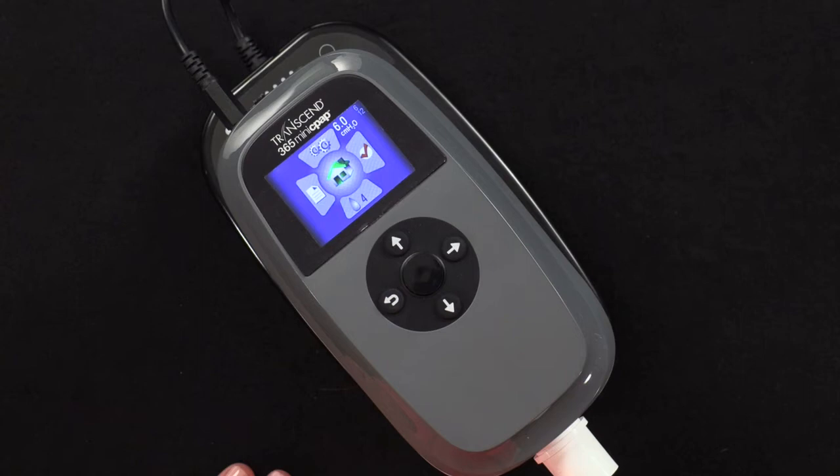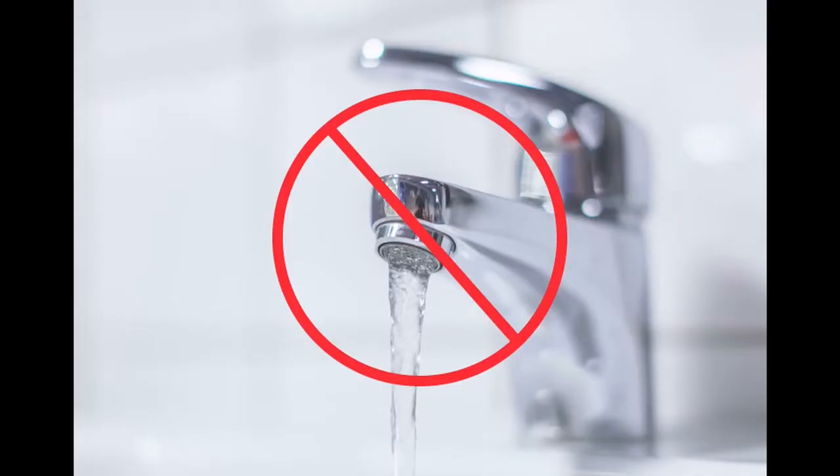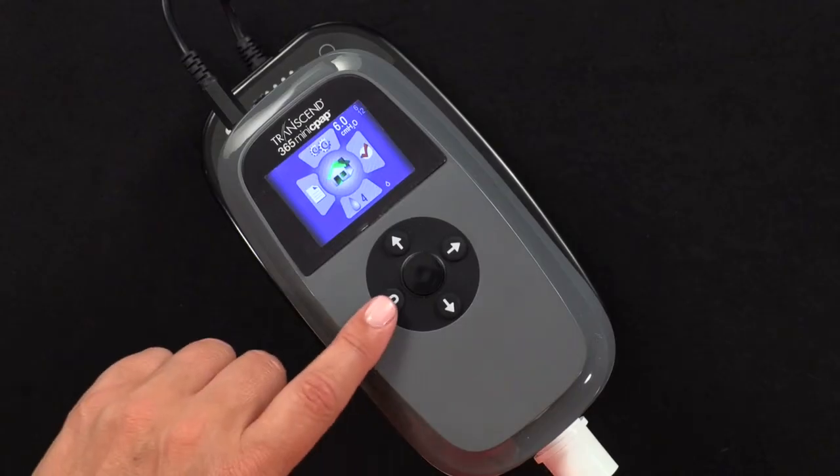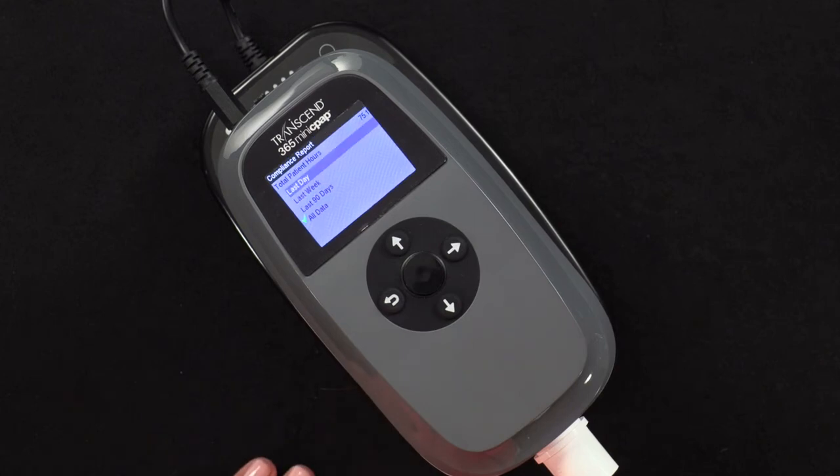home screen. It's important to note the Transcend 365 miniCPAP only uses distilled water or water that's been filtered with the approved Transcend 365 portable water filter. Do not use tap water or you will damage the humidifier. We'll cover how to use the accessory portable water filter in a little bit. Arrow to the paper icon on the left and press the center button to view detailed compliance data.